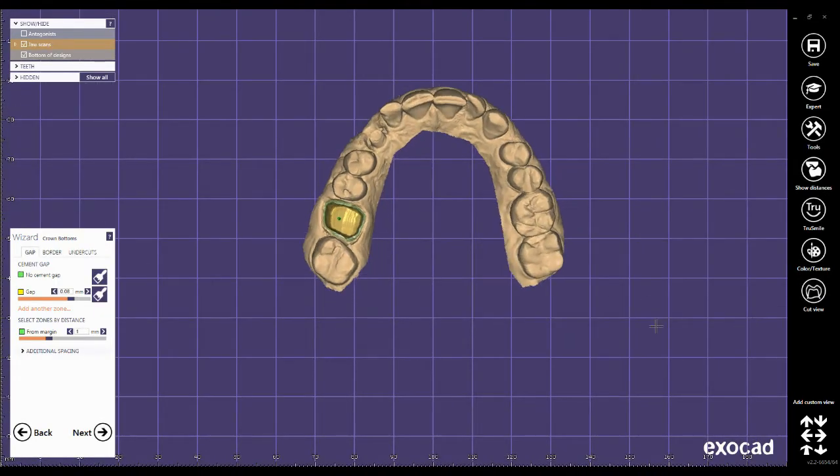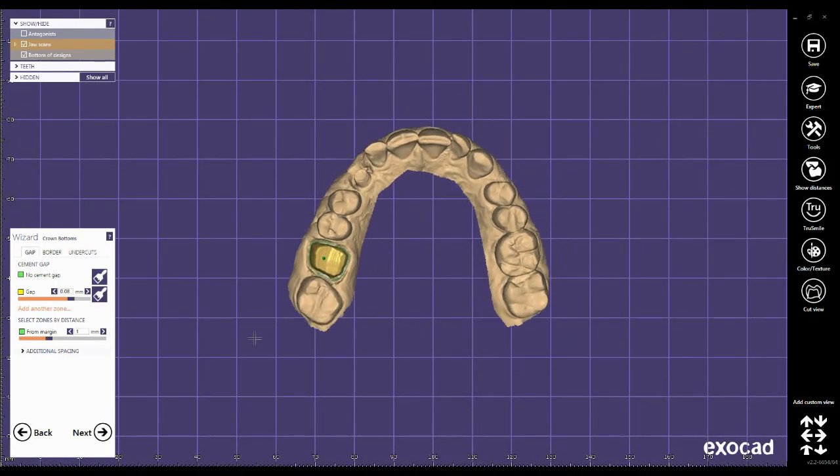Check the bottom of the crown and the gap. Click next.